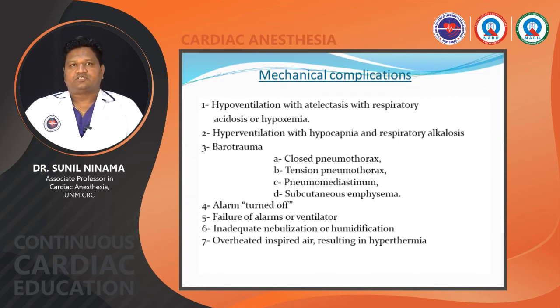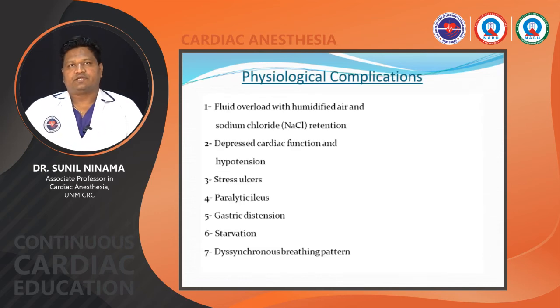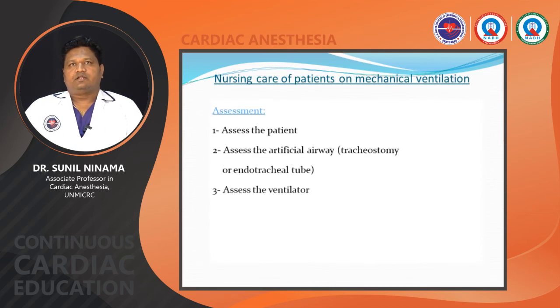And a mechanical complication is also the alarm. If your alarm is turned off, then again there are mechanical complications: failure of ventilator alarms, inadequate nebulization or humidification, or overheated inspired air, resulting in hyperthermia. Physiological complications are fluid overload, decreased cardiac function and hypotension, stress ulcer, paralytic ileus, gastric distension, starvation and desynchronous breathing pattern. Nursing care of the patient on mechanical ventilation.